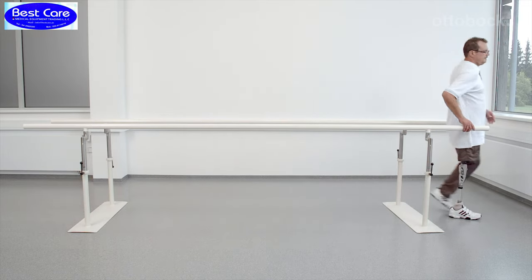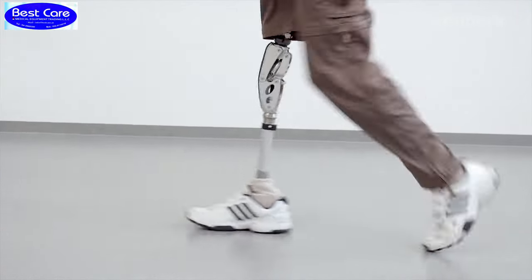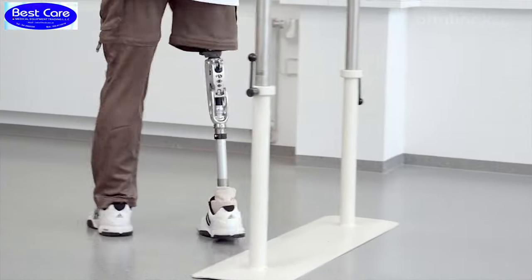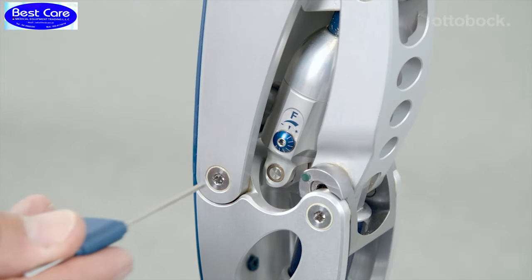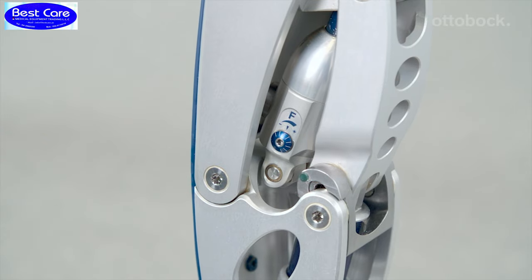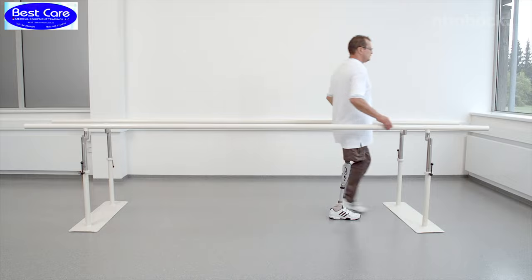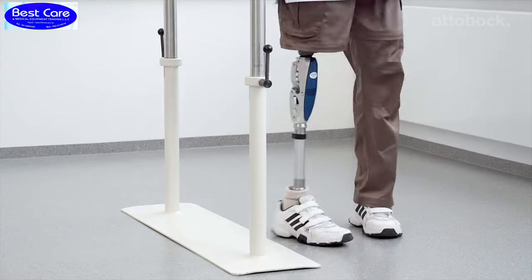The shank swings forward too quickly, which results in a hard extension stop and little ground clearance in the middle of the swing phase, resulting in an increased risk of tripping. Please reduce the flexion damping in small increments so that the knee flexion is equal on both sides and the gait pattern becomes harmonious.